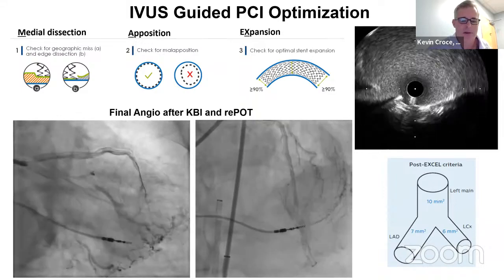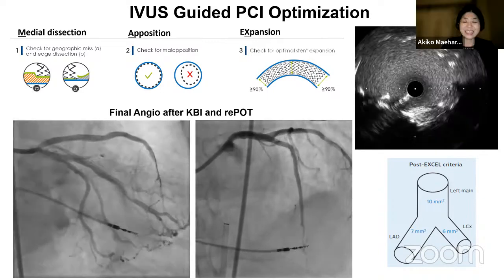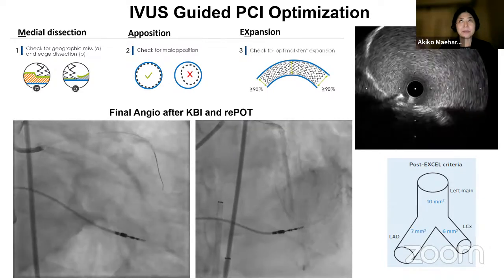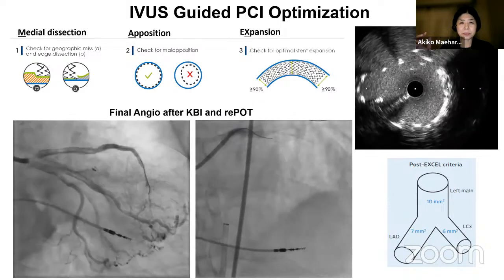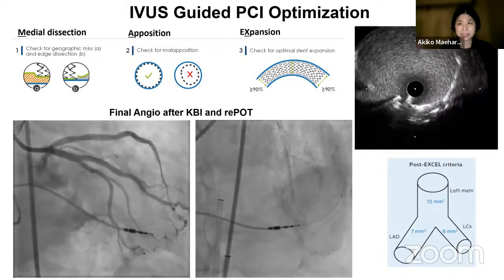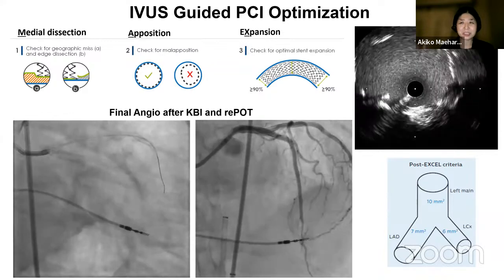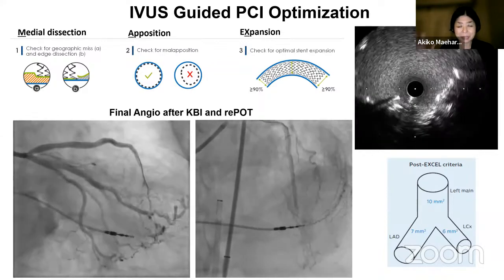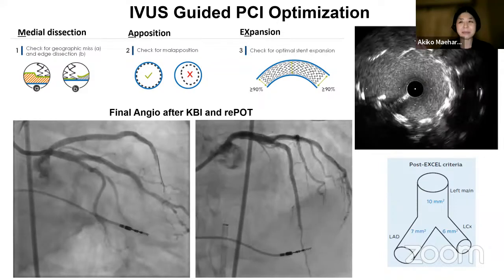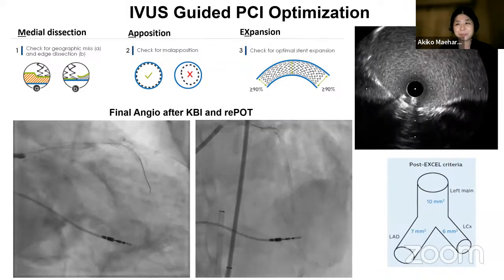But Kiki always jokes to me that she wants to see if it worked, especially when we send stuff to her core lab. I totally agree with what you said, but if you have some doubt or concern angiographically, and then your IVUS or OCT cannot pass, that's actually a super bad sign. There is a reason not to do so, so actually you have to do more. Except if you're very comfortable, I just did the final touch up and I don't think there's any issue, that's probably okay not to do so.